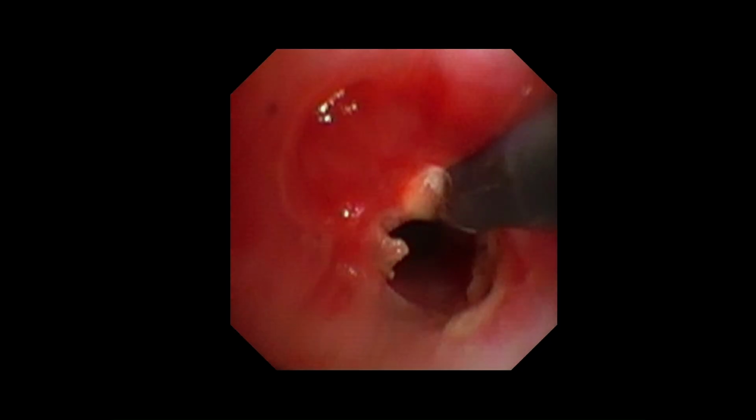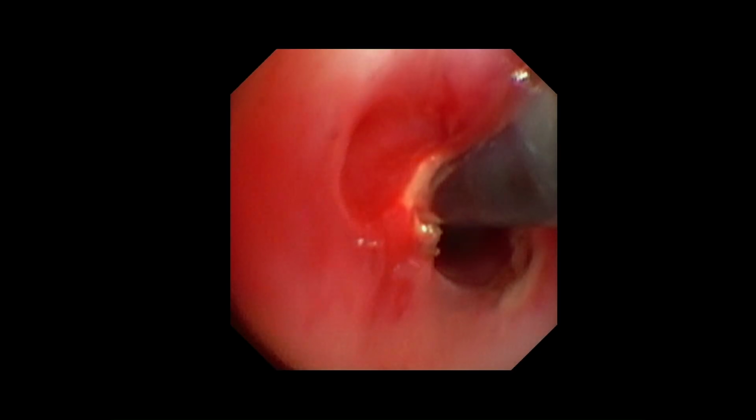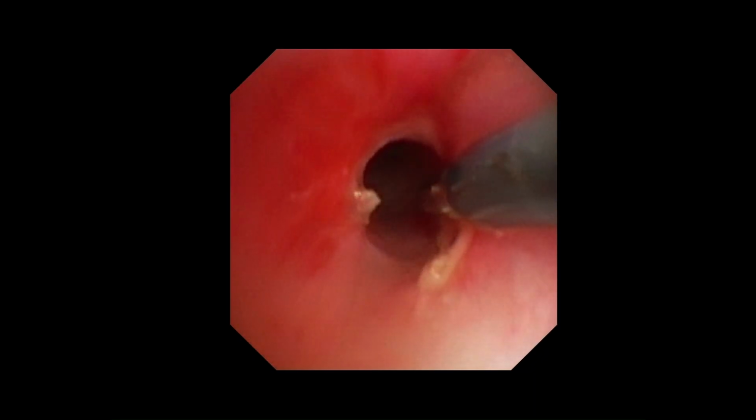So we just use a 1.1 millimeter cryoprobe, and then do freeze thaw cycles around the web, making sure the whole area is devitalized using the cryoprobe. Activation times can vary depending on the case and the thickness of the scar.